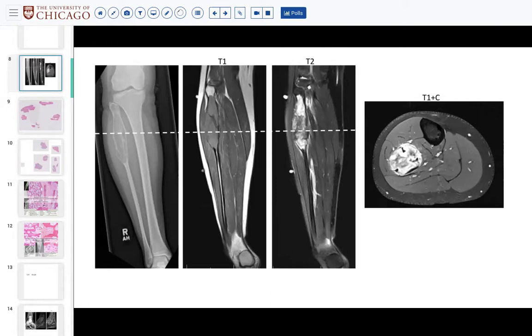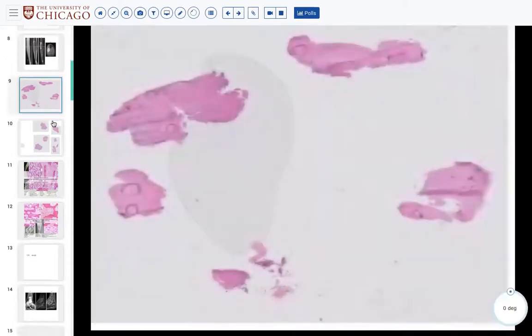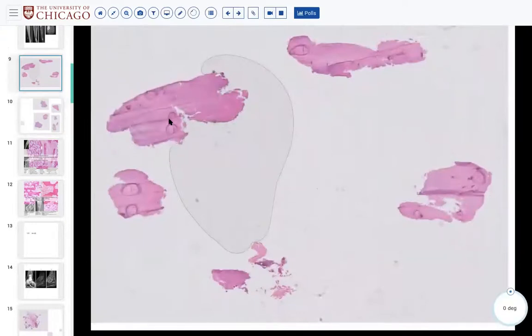Normal cortical bone is black, with the muscular tissue being more gray, the lesion being quite enhancing, and exactly, these black comma-shaped flecks are reflective of the exact same intensity of the bone. So in this case, a frozen was sent.